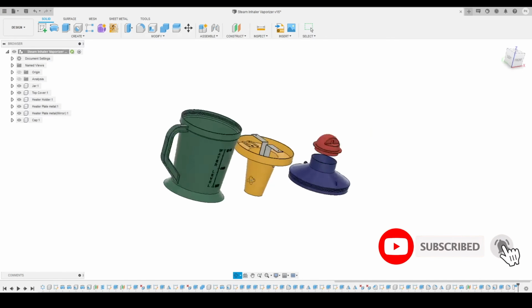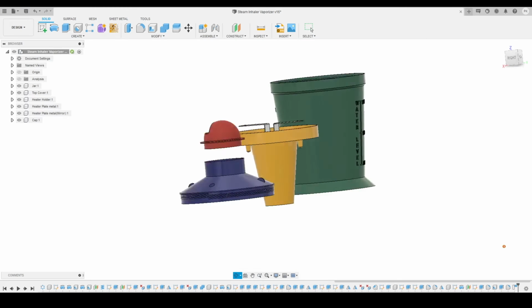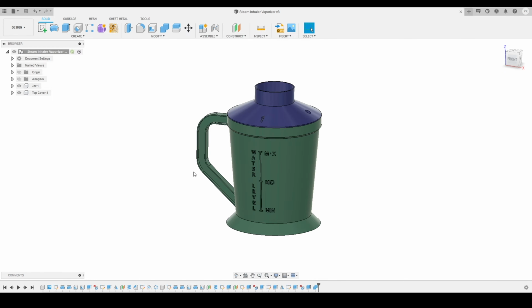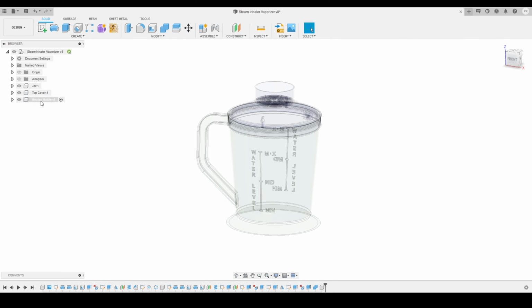So without wasting much time, let's dive into Fusion 360 and start modeling the heater plate and heater plate holder components. So now we are into Fusion 360. So we'll start with creating a new component. We'll go into the create panel, click on the new component, and here I will just give it a name. I will write heater holder over here and press OK. So here you can see the new component has been created.